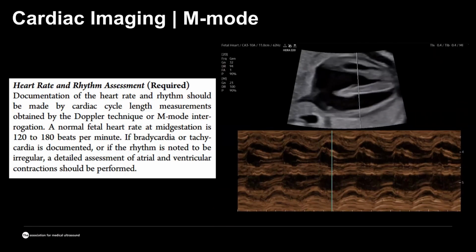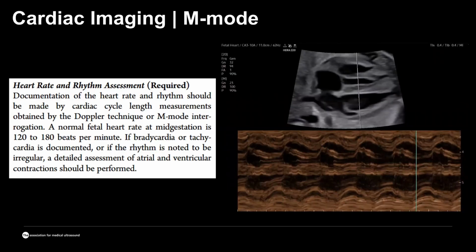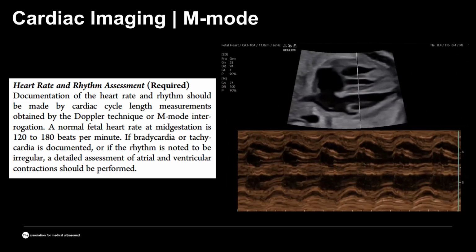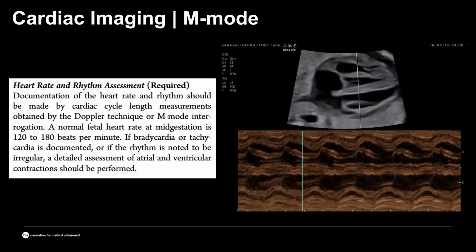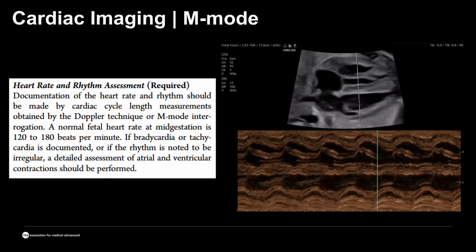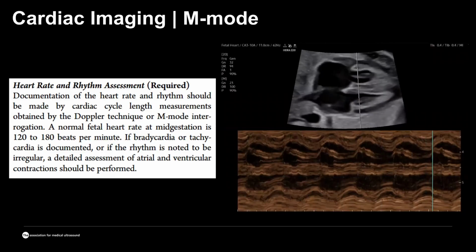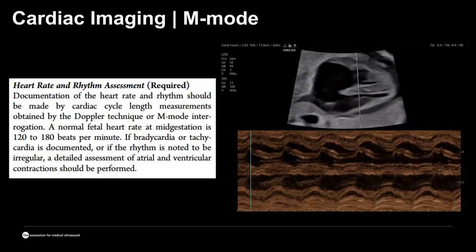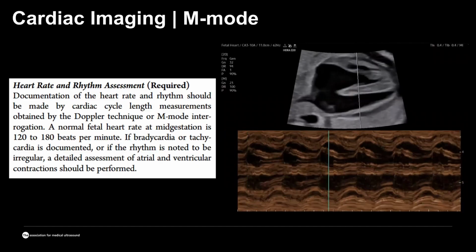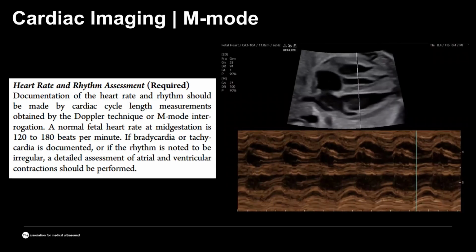But when we talk about assessment of the rhythm and cardiac function, I think the first thing that occurs to your mind, and this is what the guideline says, is that the method of choice and the first choice should be the M mode, our good old tool. But if you have any experience with that modality, you're probably well aware that it is not that easy to obtain a meaningful trace. Usually it's very small, it's not readable. So what are the key optimization steps here?